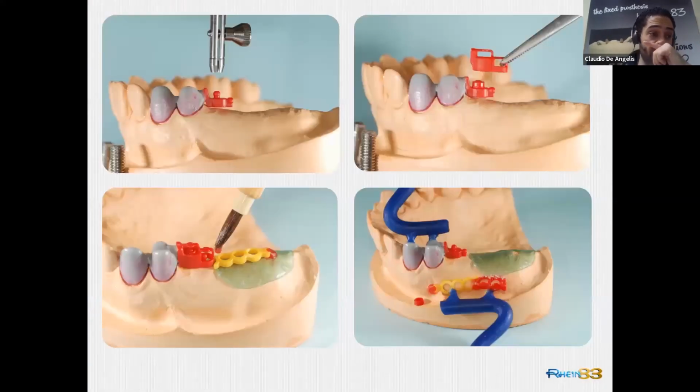So again, here also at least 2 crowns, 3 is better, 4 is even better. And again, parallelometer key. I put the attachment in compliance with the occlusal plane, perpendicular to the occlusal plane. I put again the positioning ring over the vertical sphere, and look, pay attention, check this out. You place the metal housing directly on the master model without duplication, because this attachment was intended to be used directly over the master model without making a duplication.